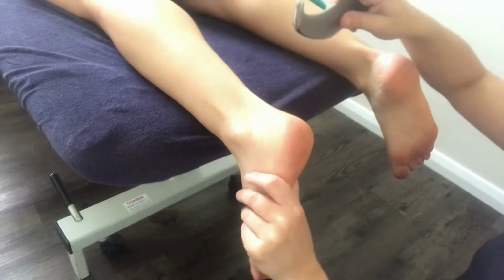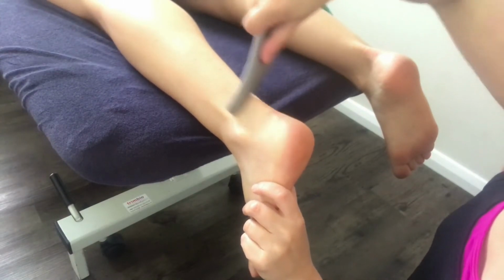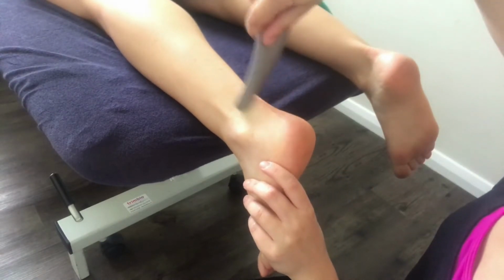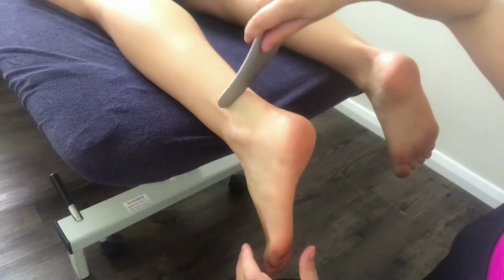Here is just another angle of working into the Achilles. So with the client prone, foot off the couch, and then you're behind the client. And again, you can do the same thing. So passive STR and also active STR, and also your METs in this position also.